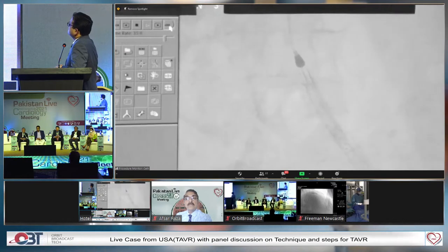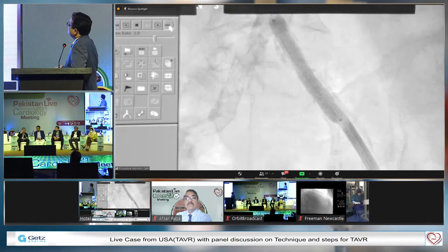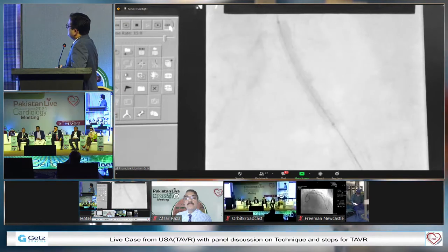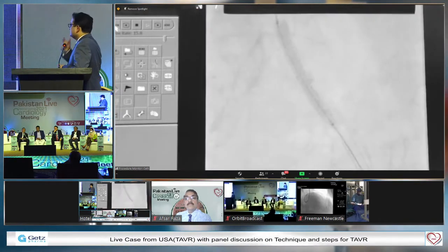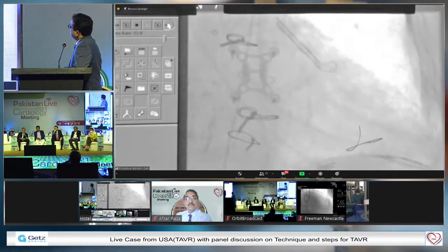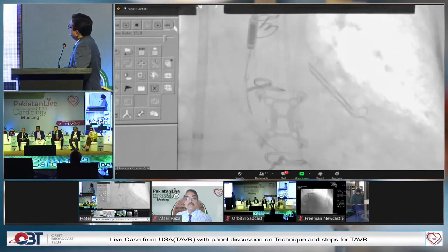And this is the EF. Meanwhile, we could not get the Impella up. So we came back, ballooned it, still couldn't get it up, ballooned it again with 10, and changed out for a Lundquist wire, and finally was able to get it all the way up. So this is the Impella going in. The Impella is in place. You can see the left atrial appendage clip there.